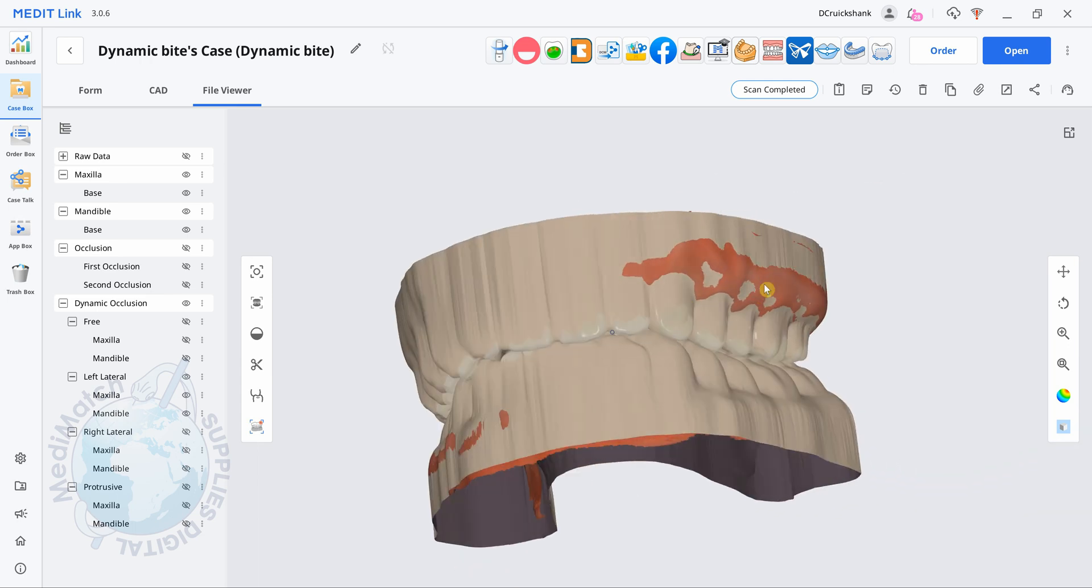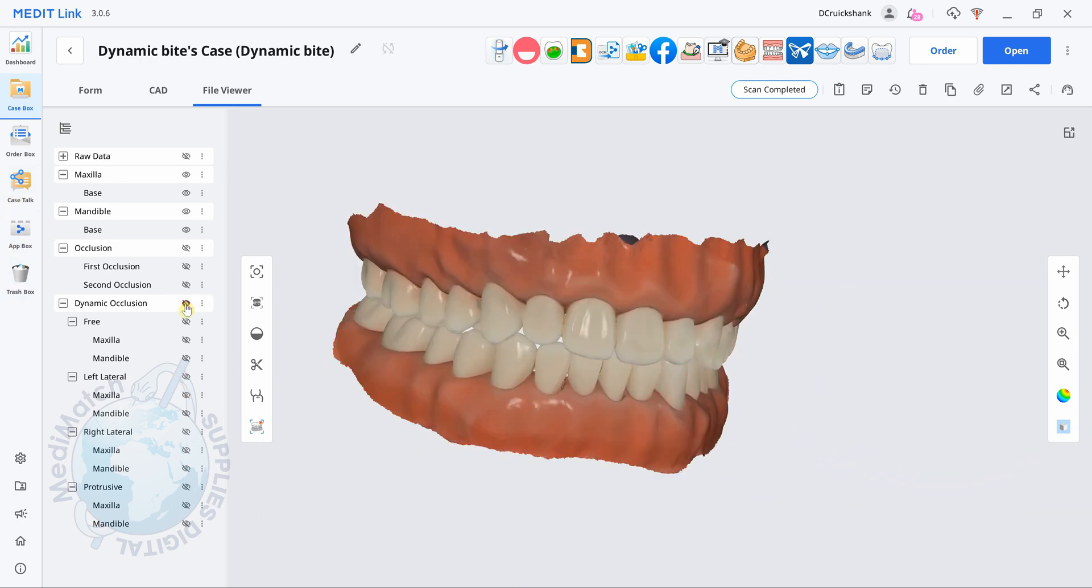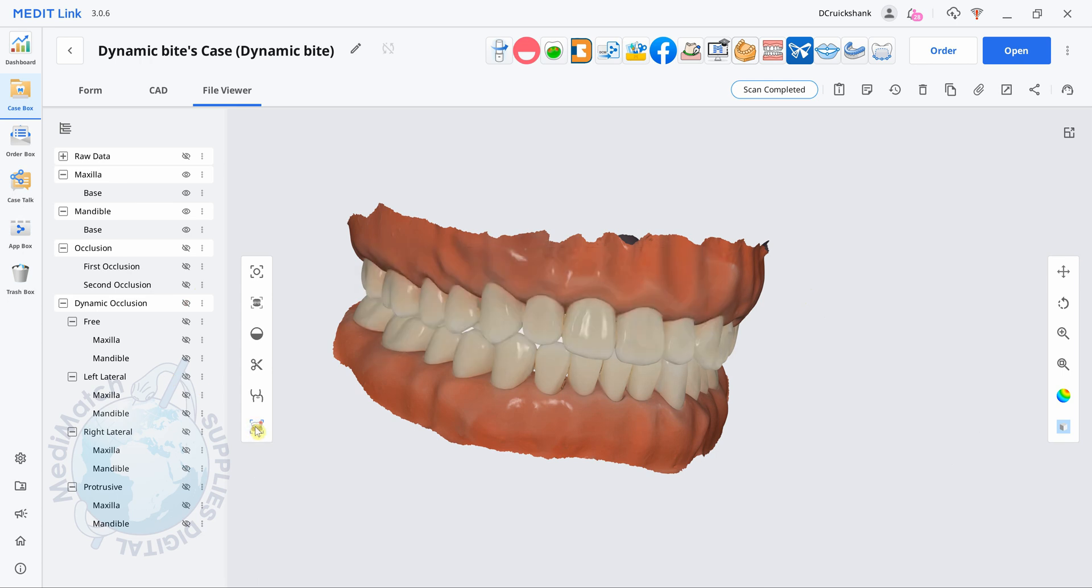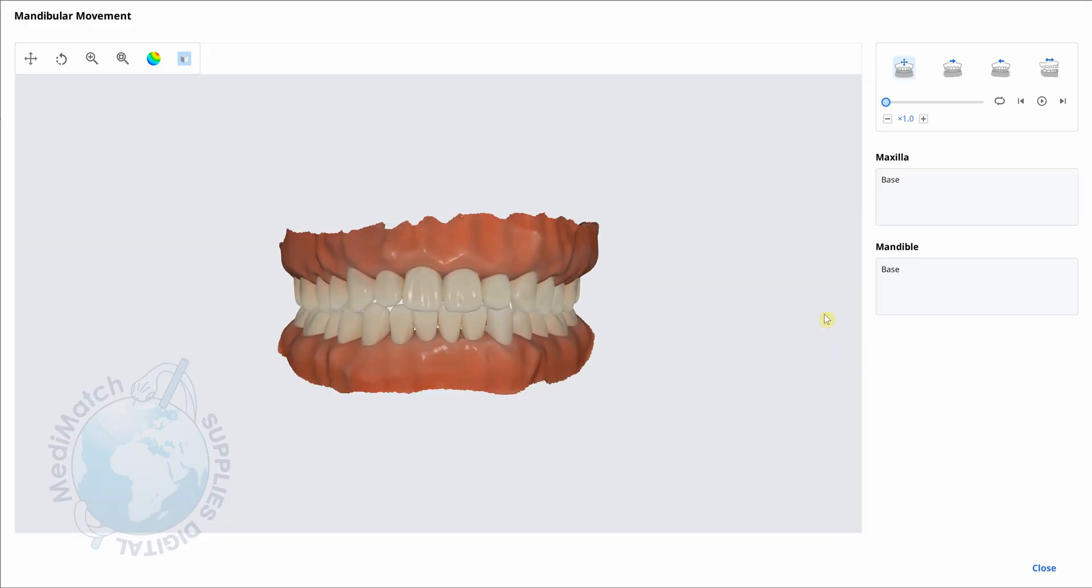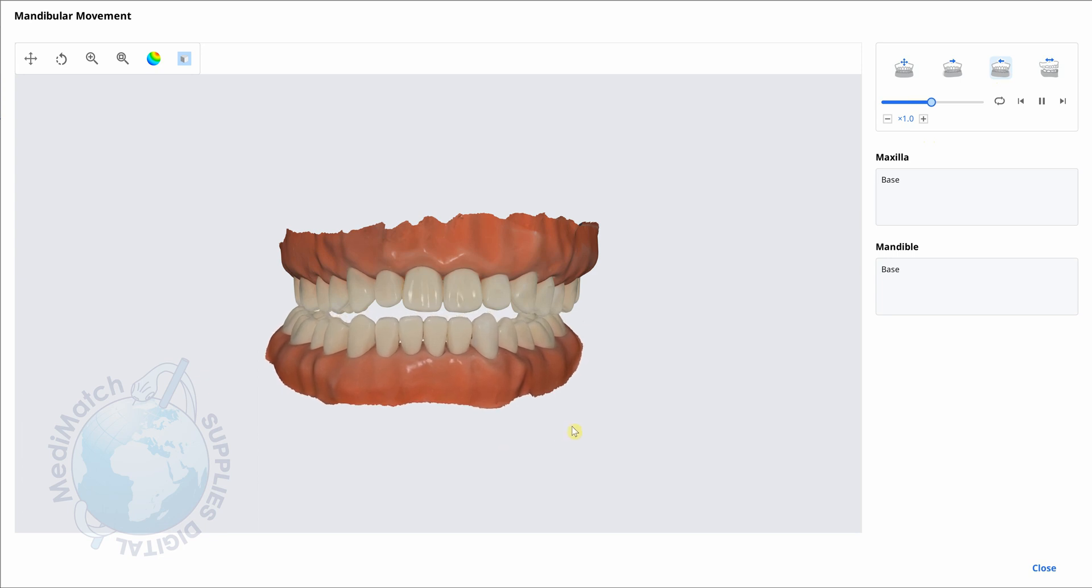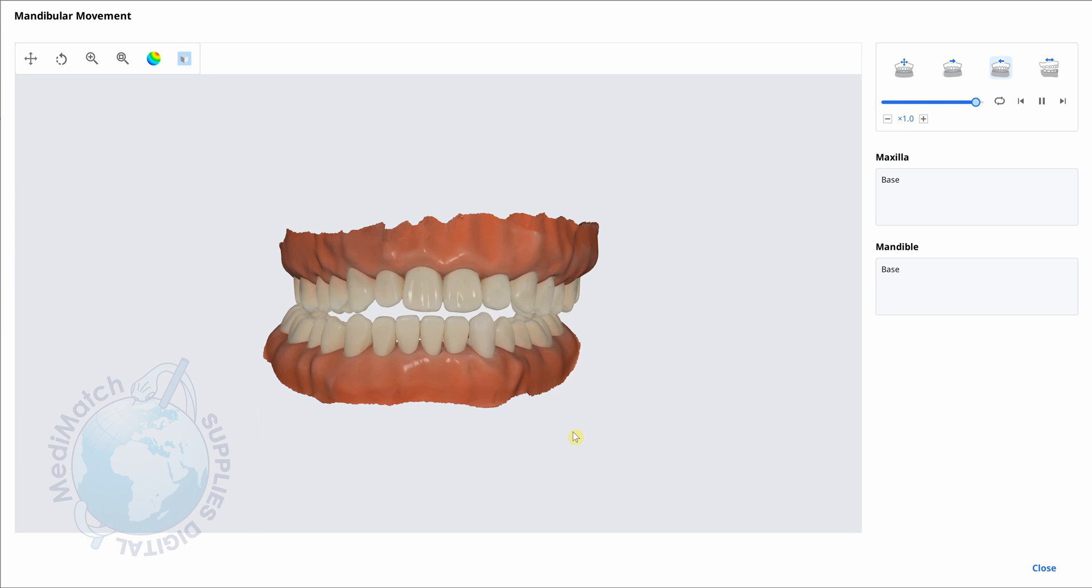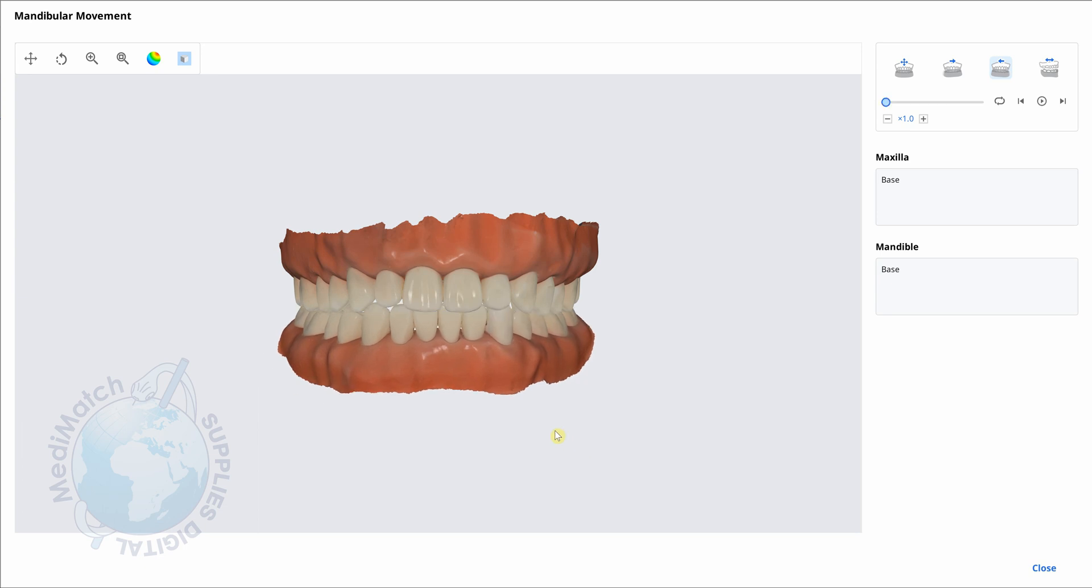Additionally to that, if we just turn this off, we've also got the mandibular movement icon here. So we can click on this, it'll open up a new window. We can click between any of the movements we just made and we can play them back. So all of this information can then be taken into a CAD package such as Exocad, Exocad Chairside.